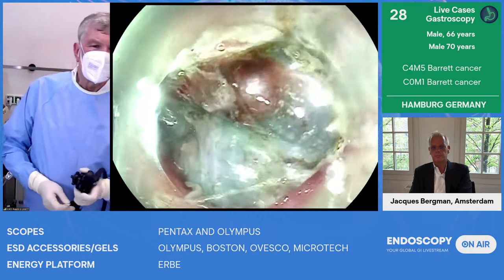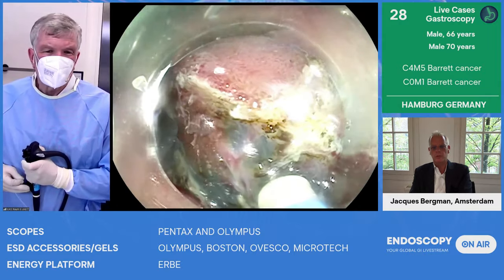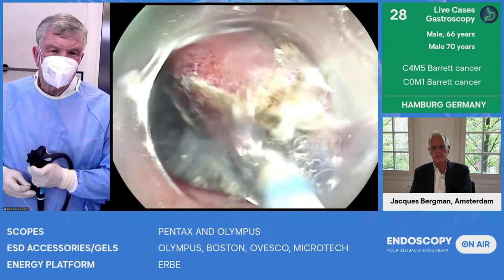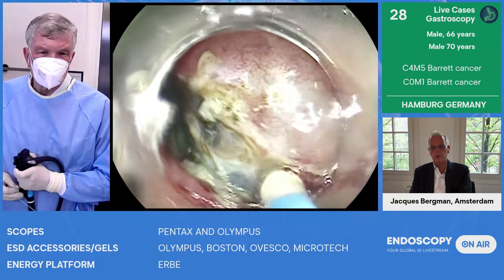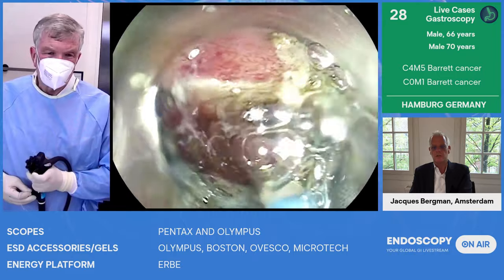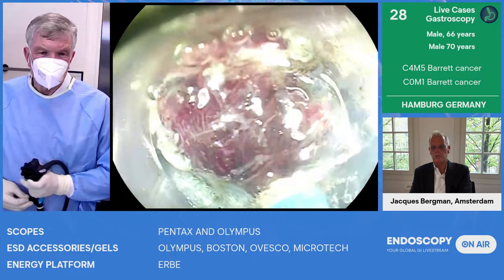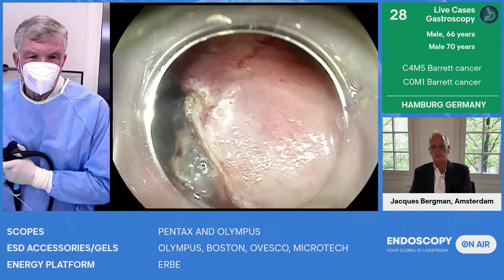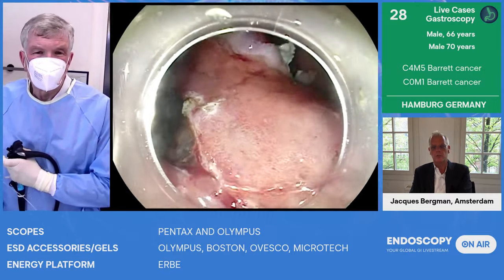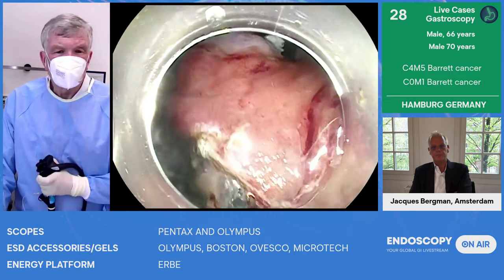Absolutely. Chuck, we are running a little bit out of time. You're doing all of this with a closed knife. I think it's important for the audience to realize. So Thomas is moving quickly, but his knife is in. Therefore he runs very little danger of damaging the deeper muscle layers. If you would do this with the knife out, then logically the movements would have to be much more subtle and much more elegant. But here you can just make quick steps.